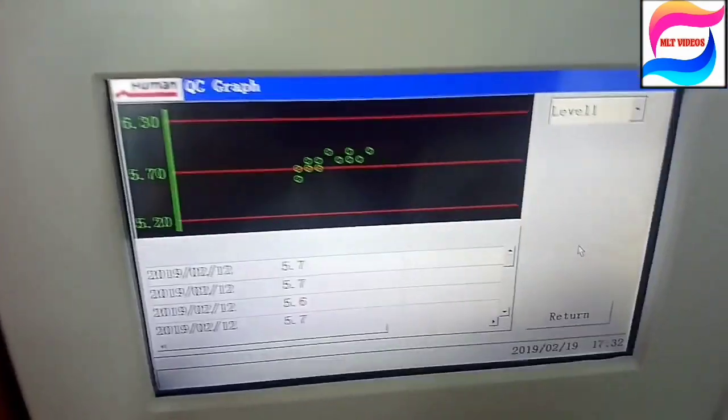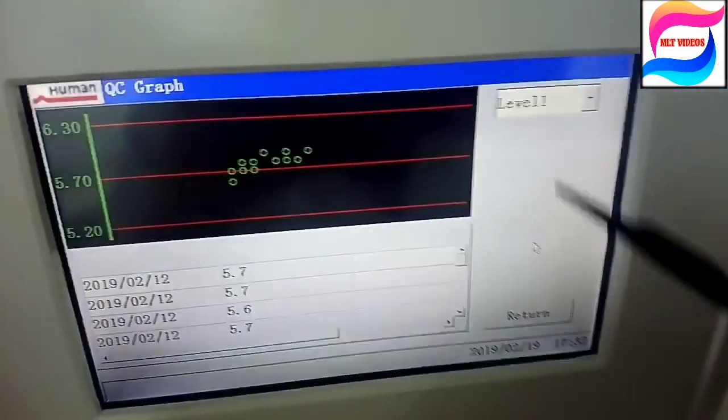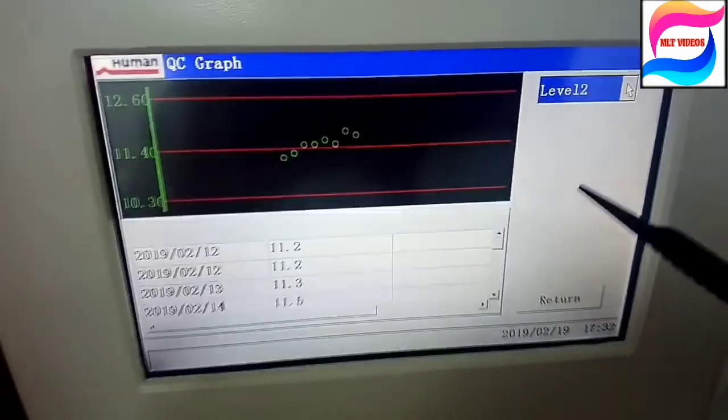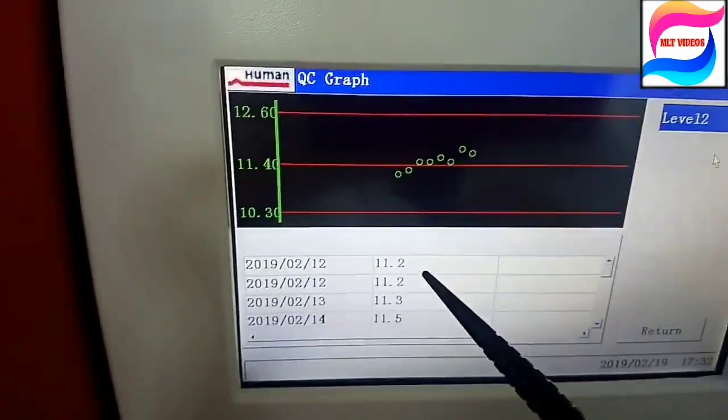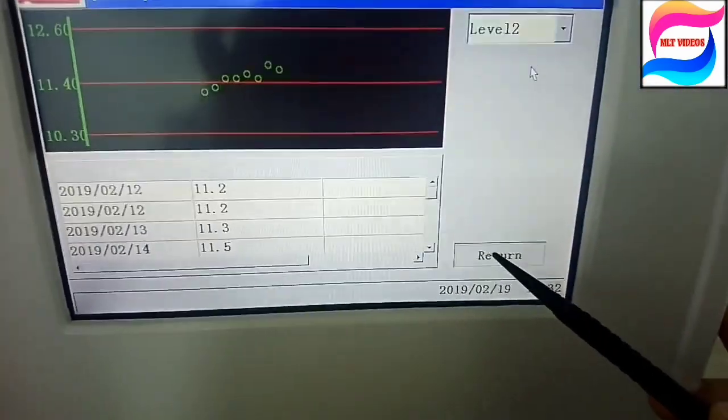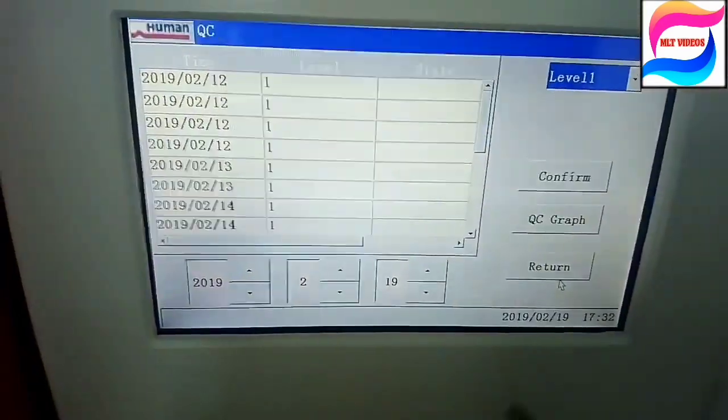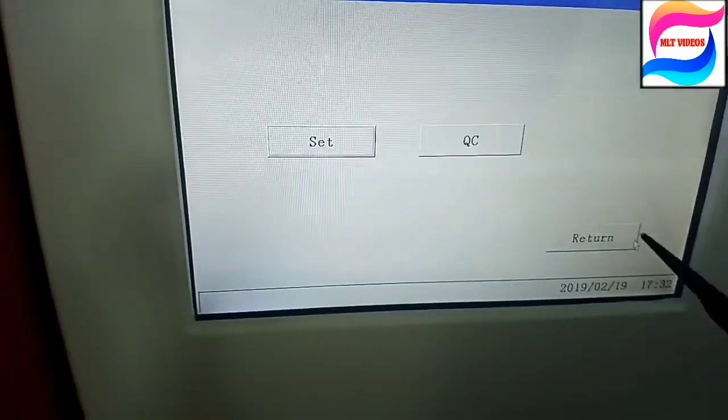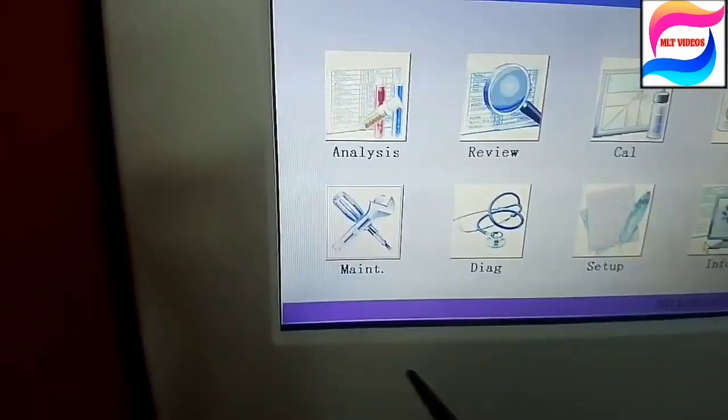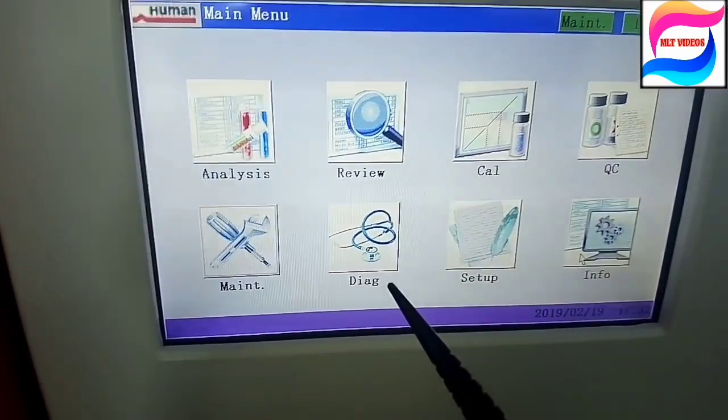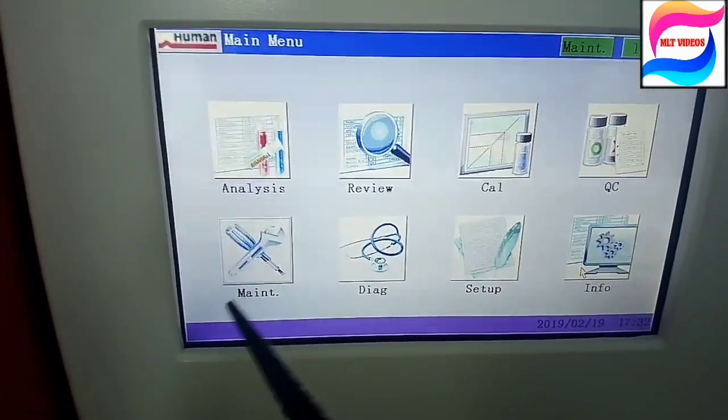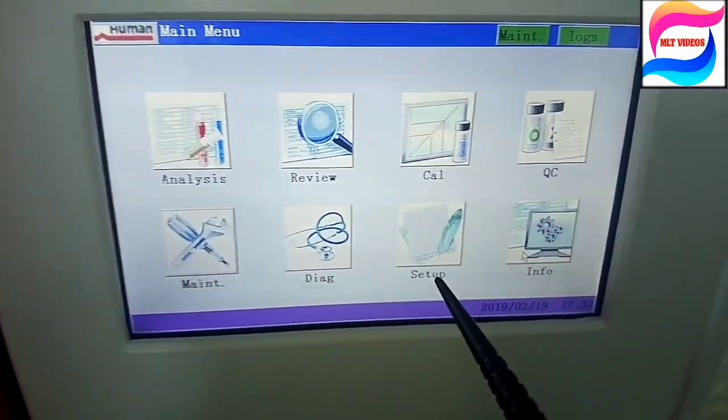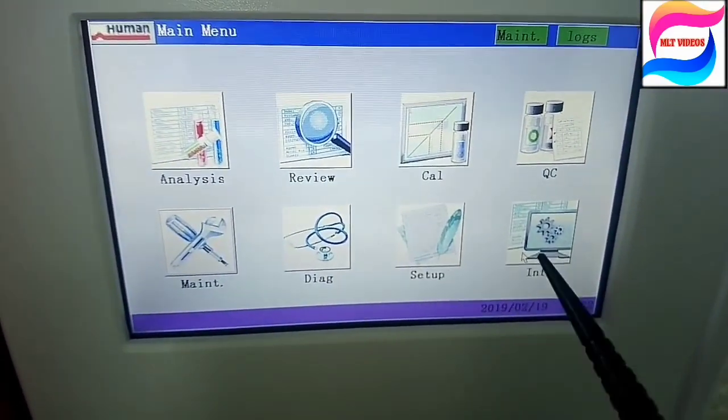Graph will come like that. LJ graph is available, but one drawback only for this machine is that you cannot take the print of graph. Only you can see the graph inside the machine. Print is not possible. Patient results will come by print but graph unfortunately we will not get by print.